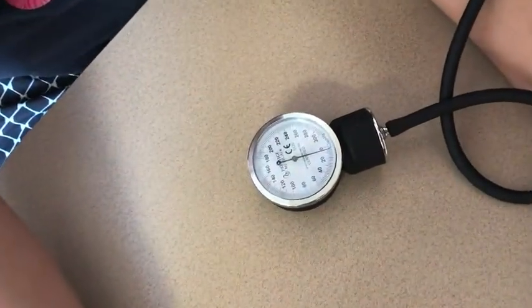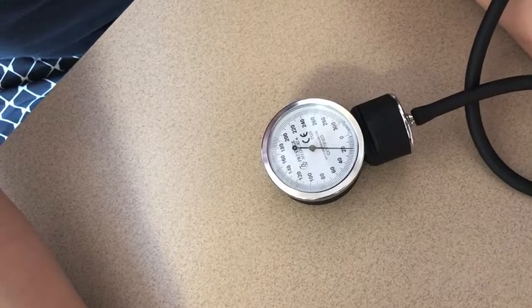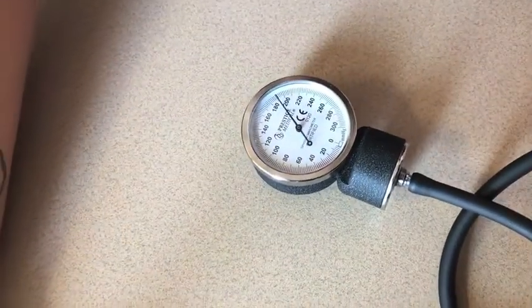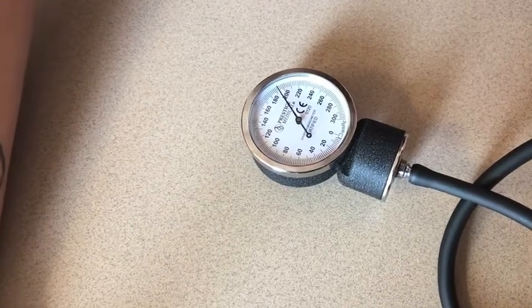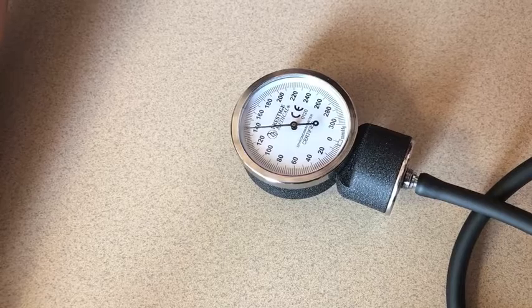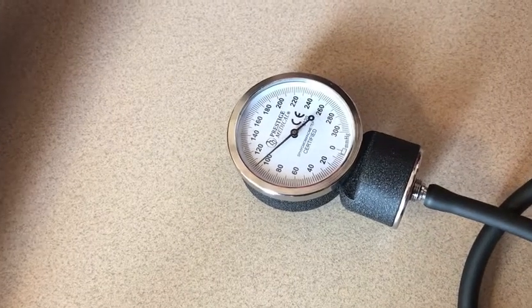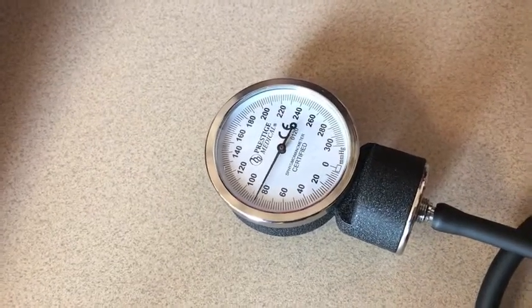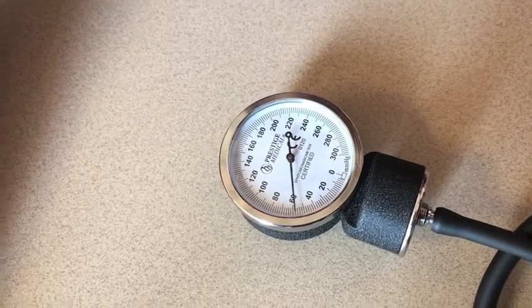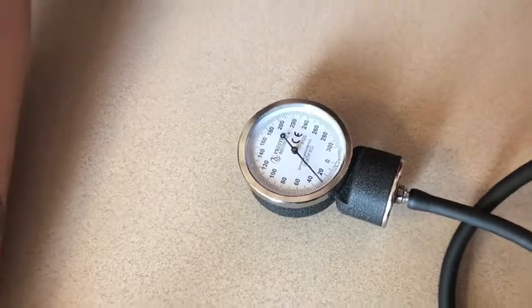Using the hand bulb, inflate the blood pressure cuff to 200 mmHg. Turn the dial slowly to the left just enough to release pressure at a rate of 2-5 mmHg per second. Listen closely for Korotkoff sounds. At the onset of sound, take note of the pressure — this will be the systolic blood pressure. The disappearance of sound will represent the diastolic blood pressure.